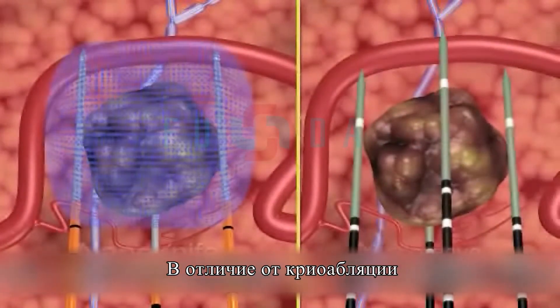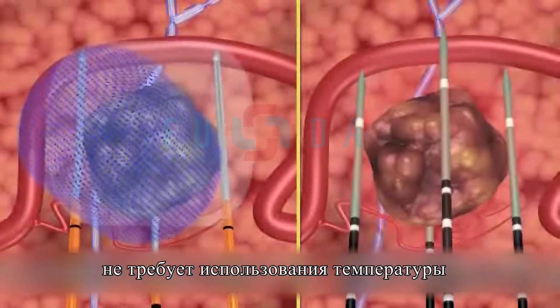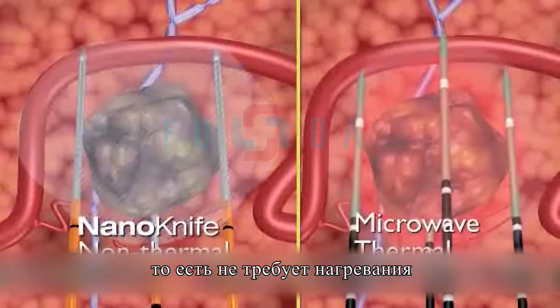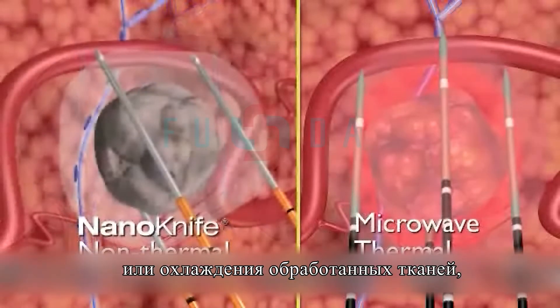Unlike cryoablation or microwave ablation, which use thermal treatment to destroy tissue, the NanoKnife IRE system treats without exposing tissue to extreme cold or heat, eliminating a major cause of treatment failure and possible damage to tissue adjacent to the treatment area.